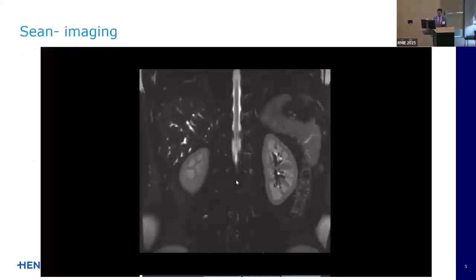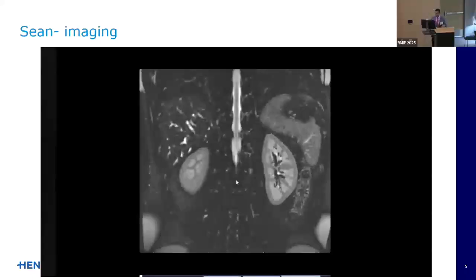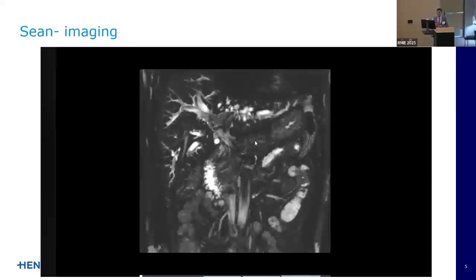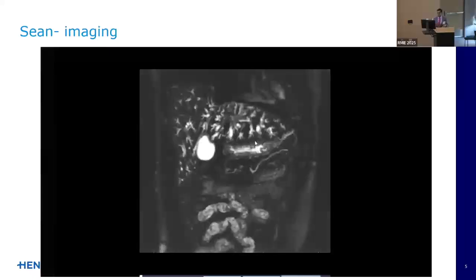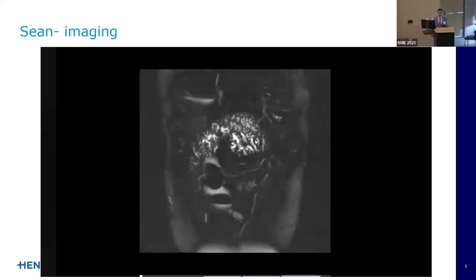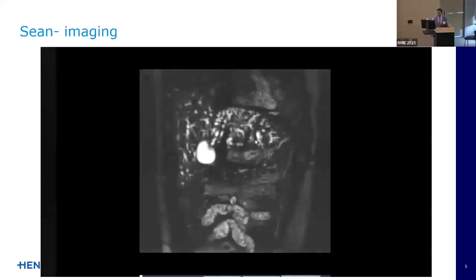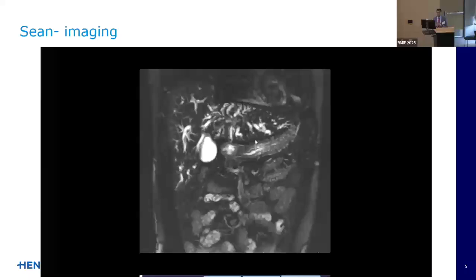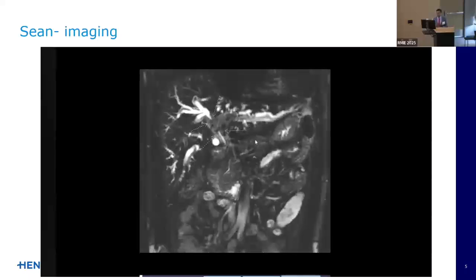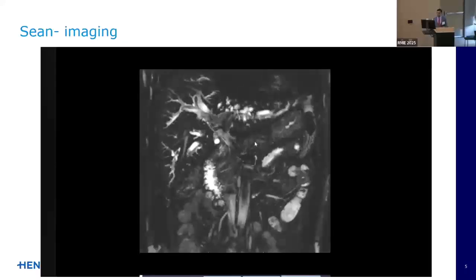One thing we talked about earlier, a little harder to read in ultrasound, but for our fellows, we should be very comfortable in looking at MRIs and especially MRCPs. So this is just a sequence, and we'll get a nice big arrow sign in a moment demonstrating a hilar stricture. But I really encourage you, everybody, to look at these images yourself and come up with your own procedural plan. So here you can start to see all of the dilation of the left and right and a clear infiltrative lesion at the hilum there.